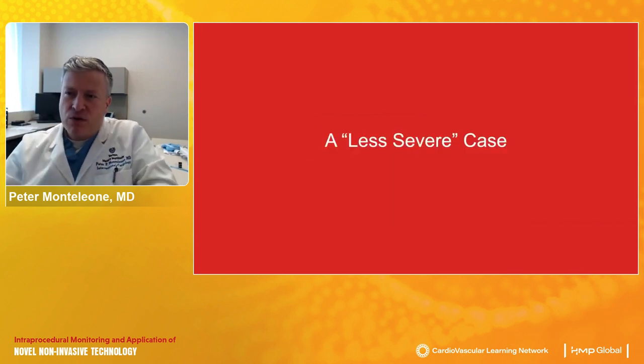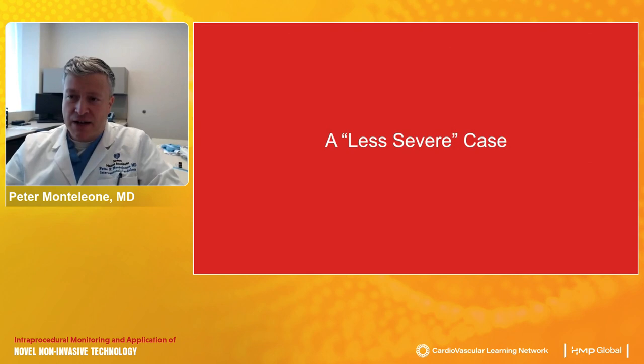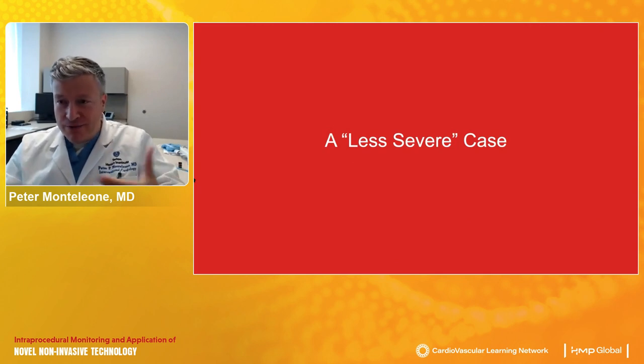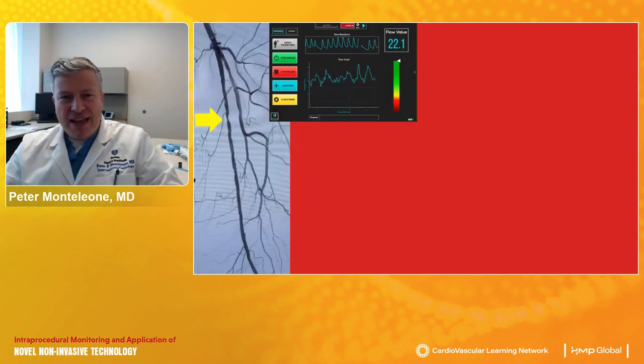So what about a quote-unquote less severe case? So this is yet another patient who came in with claudication that was profoundly lifestyle limiting. This was an individual who could not do their job, which required quite a bit of working in the field delivering packages, because all of a sudden they had this disabling left-sided extremity claudication. The angiogram's not terrible there, but like any proceduralist should do when we're evaluating these patients, this isn't the first test that we had.